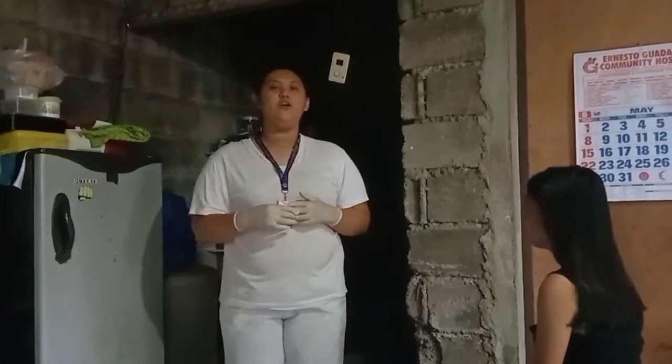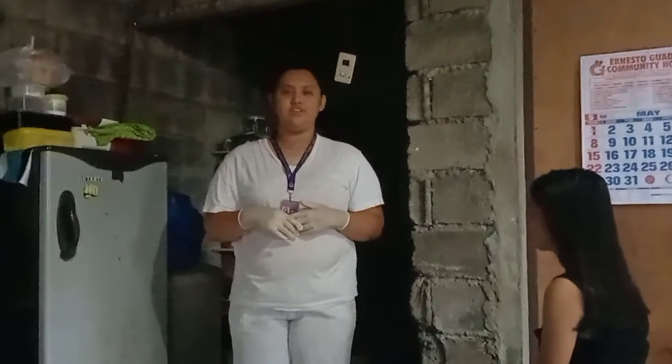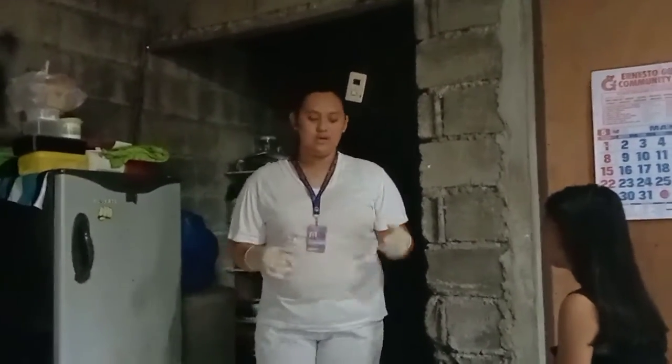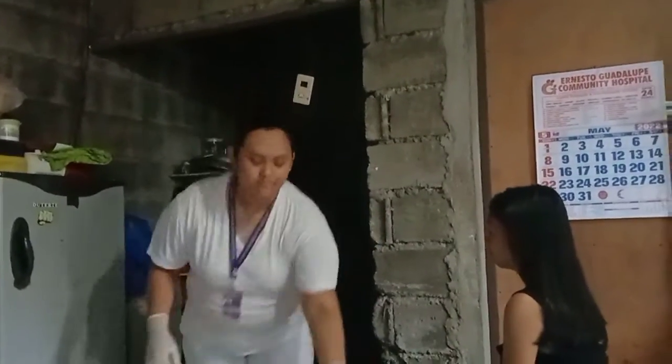Perform hand hygiene and observe appropriate infection prevention procedures, to protect myself from infection and spread of microorganisms. Reminder to apply clean gloves to reduce the risk of exposure to microorganisms and other infections. Arrange the medication card on the hypodermic tray with the corresponding medication so that we can prevent confusion later on. So as you can see, I already arranged it.